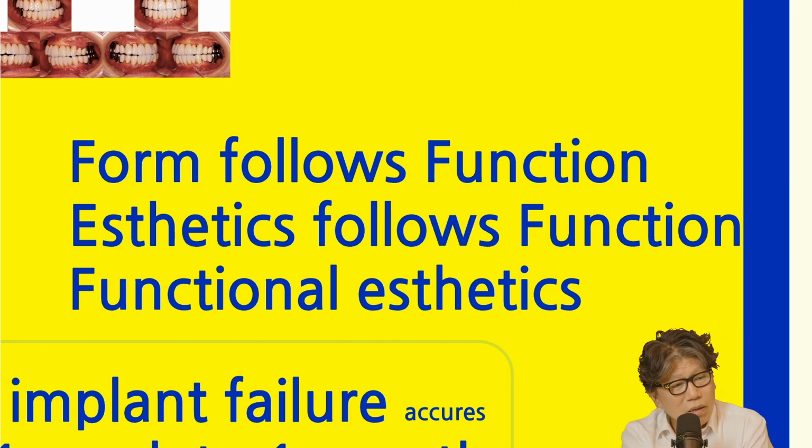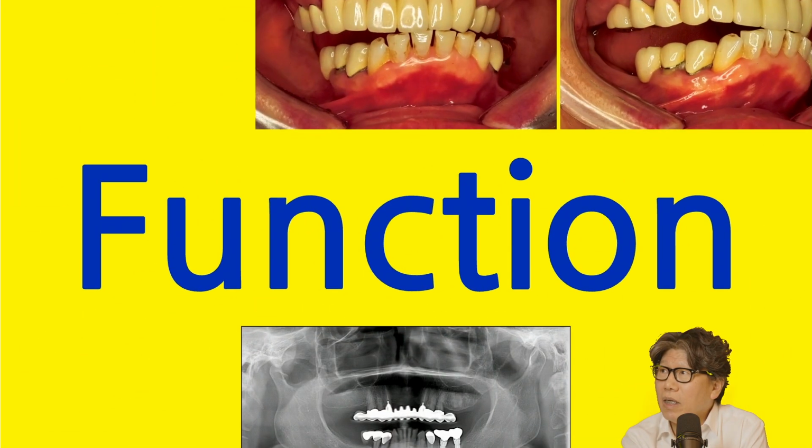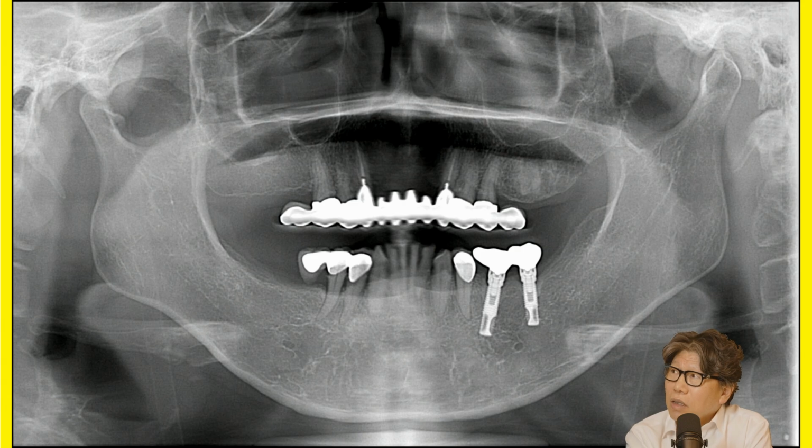It's aesthetic because we did periosurgery and made a gingiva. Then the prosthesis is aesthetic because it's a nice color. It's a little bit of a stretch to claim that. So if possible, you want to put the fixture in a good place, in a good orientation, and make it functional.